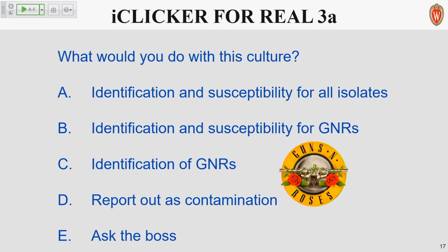I was going to say the same thing. We recently went from having the 3 plates to just having the blood and MacConkey, and it seems to me that from making that switch, we do a lot more susceptibilities on gram negatives that we may not have needed to do if we were able to see underlying that it was actually mixed, especially if you have something like a Proteus or a Kleb that's completely covering everything. That's just been my opinion, and there have been times when I really wish I could see what was going on. Especially if you have a low count of gram-negative rods. That's a good point. Thank you.